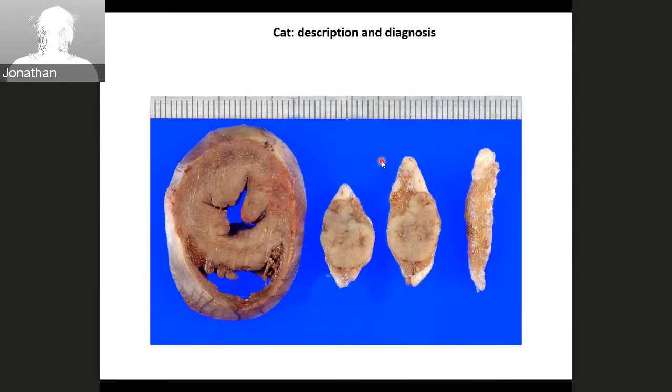Thanks. So this is a transversal section of the heart at the level of the papillary muscle on the left, and we can see, I believe, some on the right hand side. Sorry, but I lose your voice.